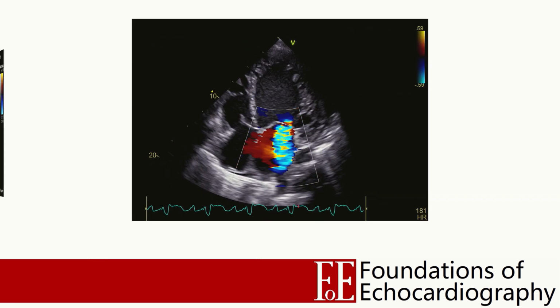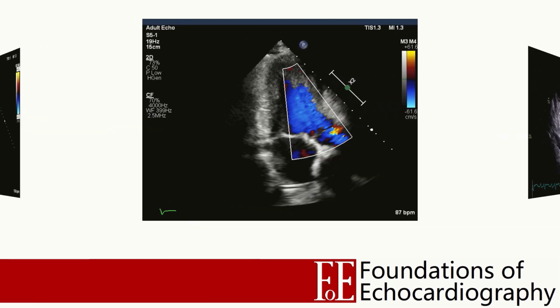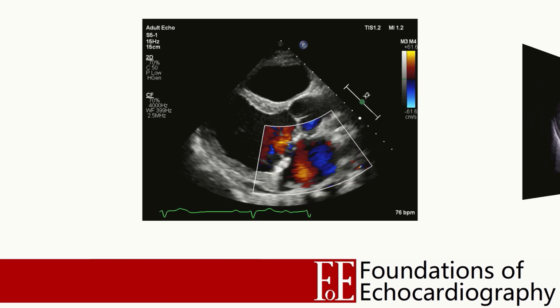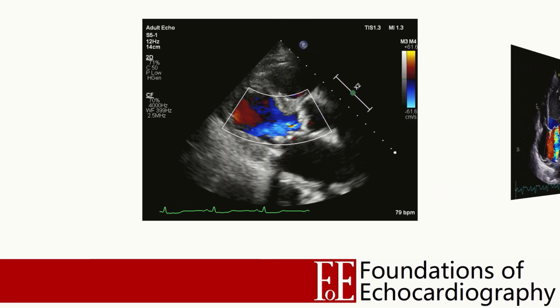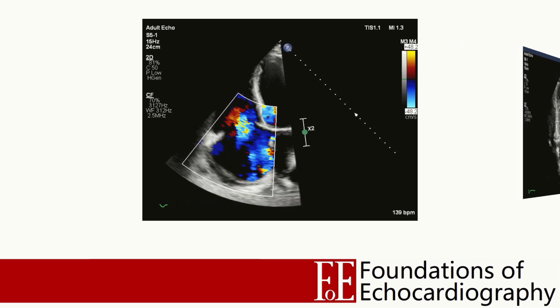We've touched on the Doppler principle previously, as part of our Level 1 series, when we discussed the generation of colour maps. I've debated the idea of referring the audience back to that video before watching this one, but ultimately I've elected to create a lecture that stands alone. So if you've never seen that lecture before, then I definitely recommend that you check it out, but it's far from mandatory. Necessarily, this means that there will be some overlap between that previous lecture and this, but hopefully the descriptions here will serve as useful revision rather than being tediously repetitive. Okay, let's get on with it.